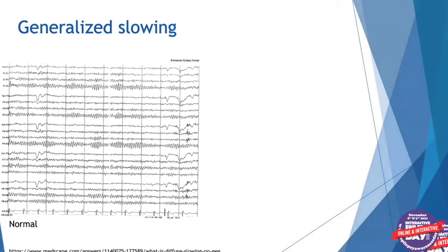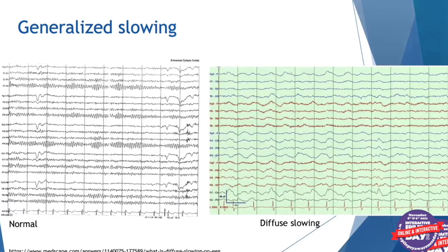Here's a side-by-side comparison. On one side is the normal EEG, and on the other is an EEG demonstrating diffuse slowing. The green lines represent one second. We see slower waves occurring roughly once per second in the slowing example, compared to the normal study where faster frequency activities are visible, particularly in the posterior regions of the head.